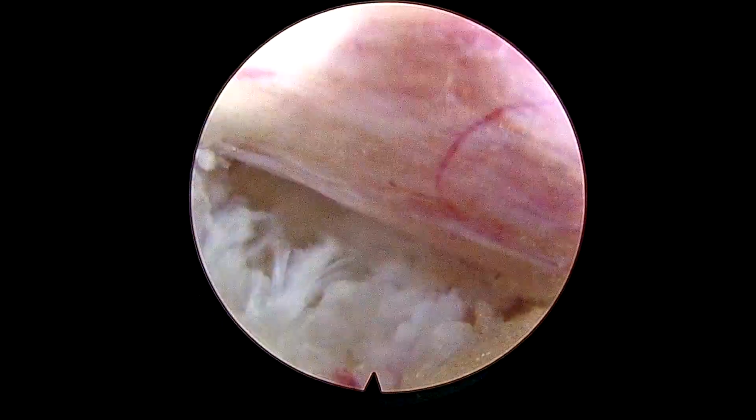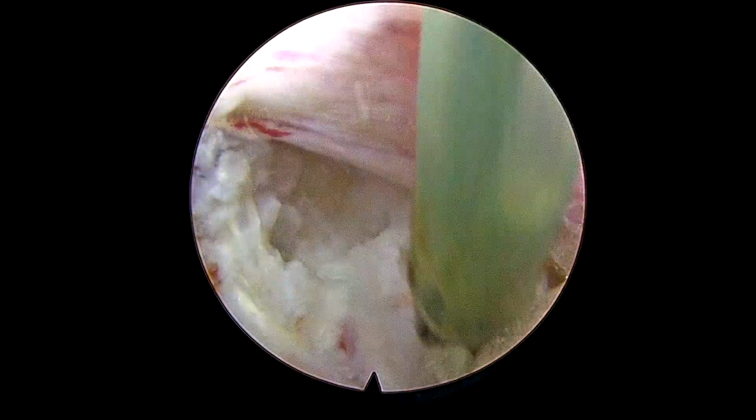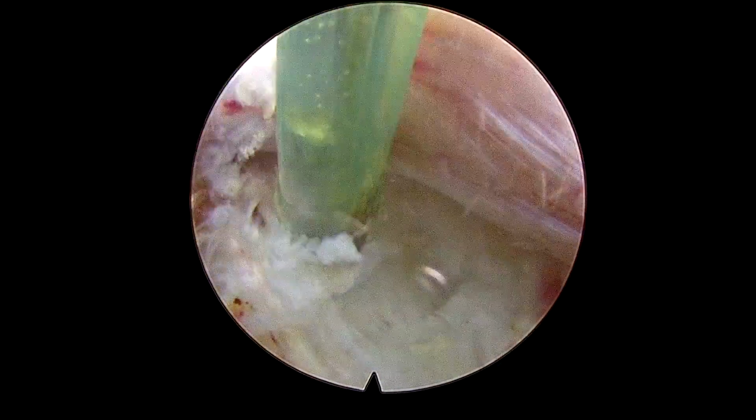So here I am removing the hard annular part near the inferior end plate. So you can see here, this is the hardened annulus here. This is the annulus in the lateral recess.